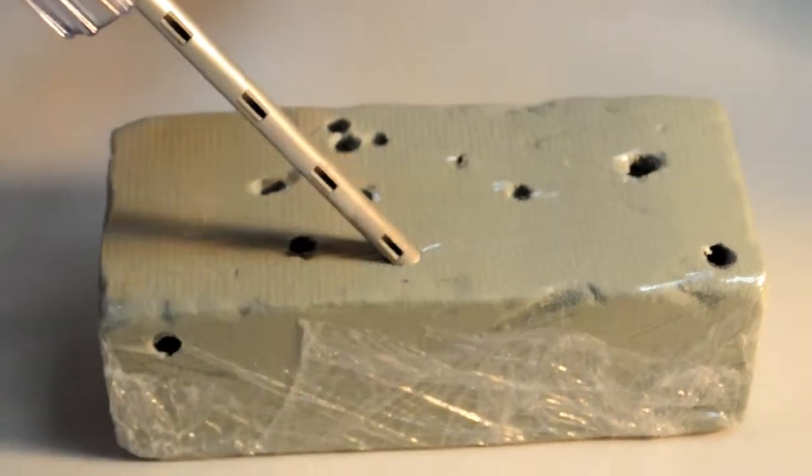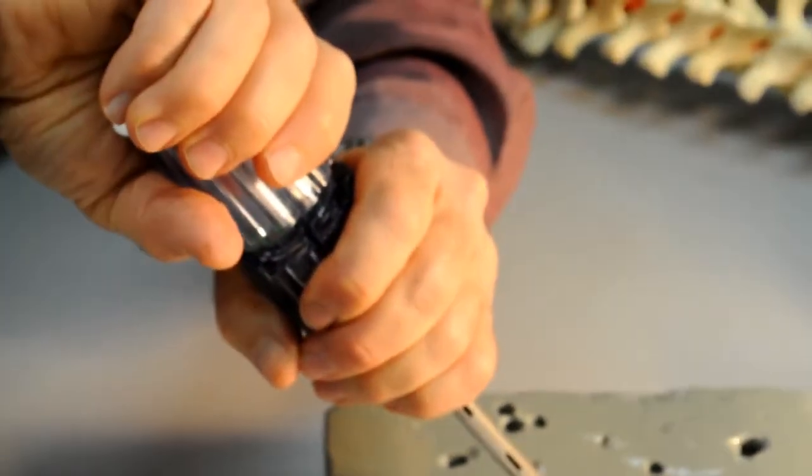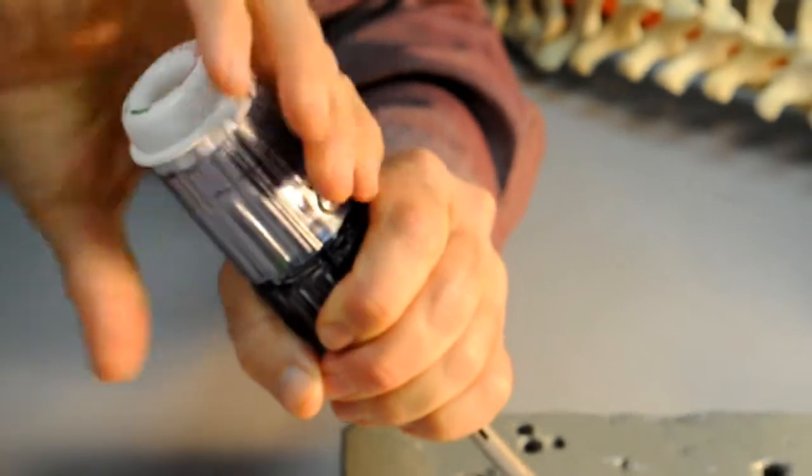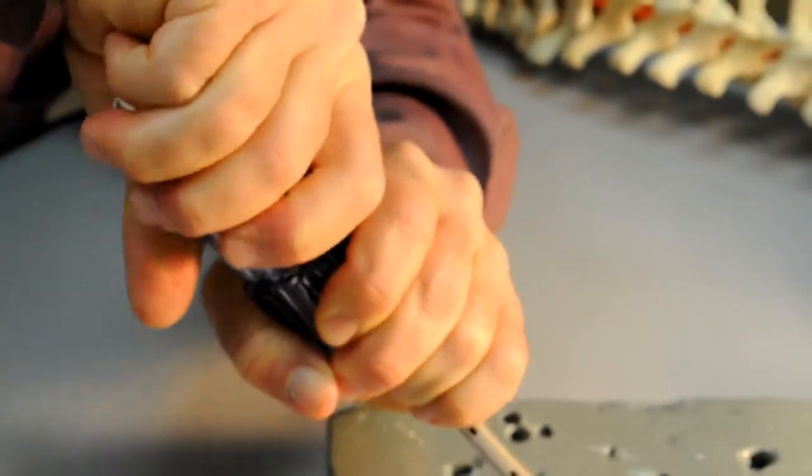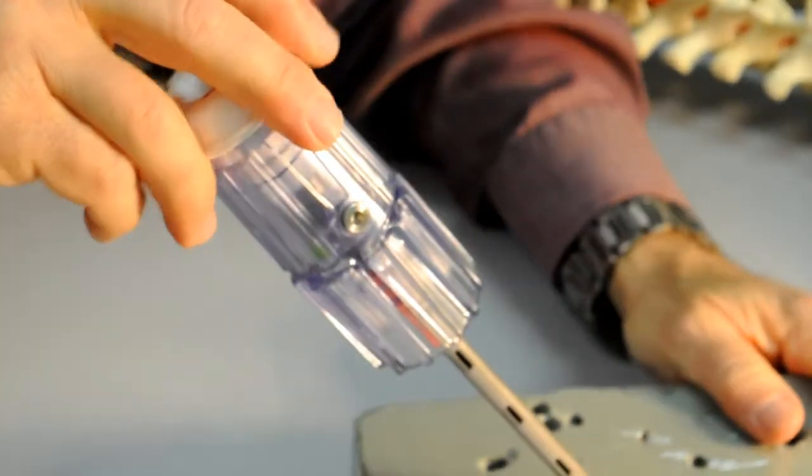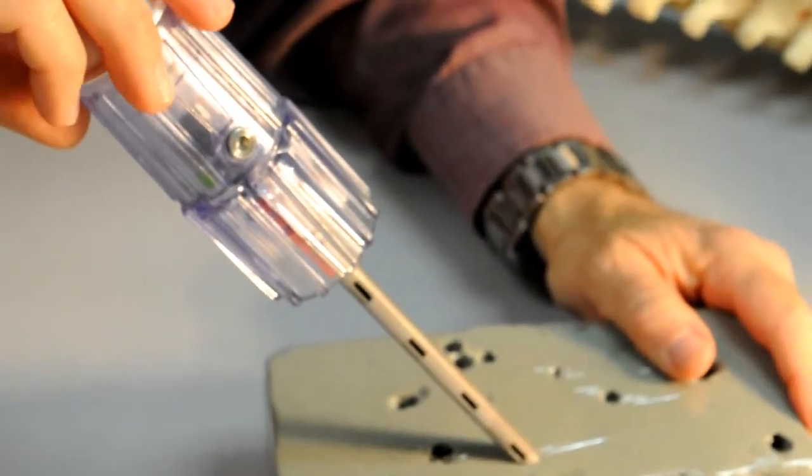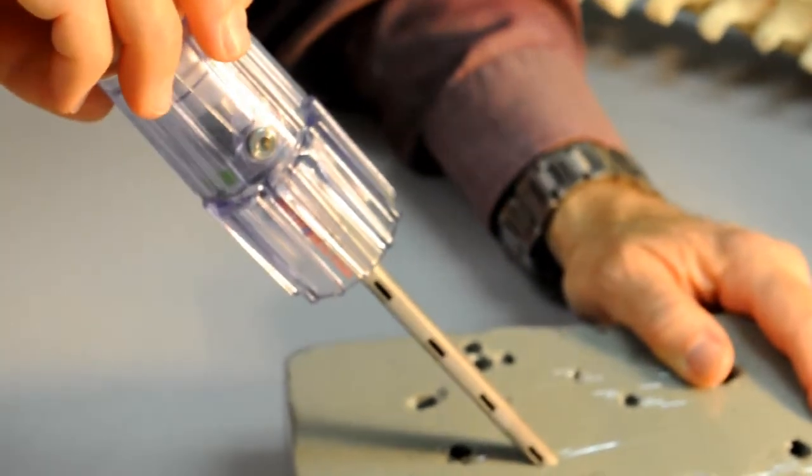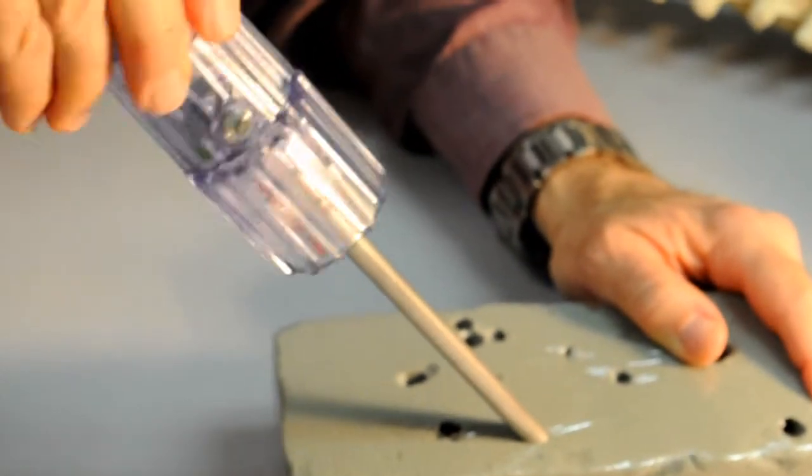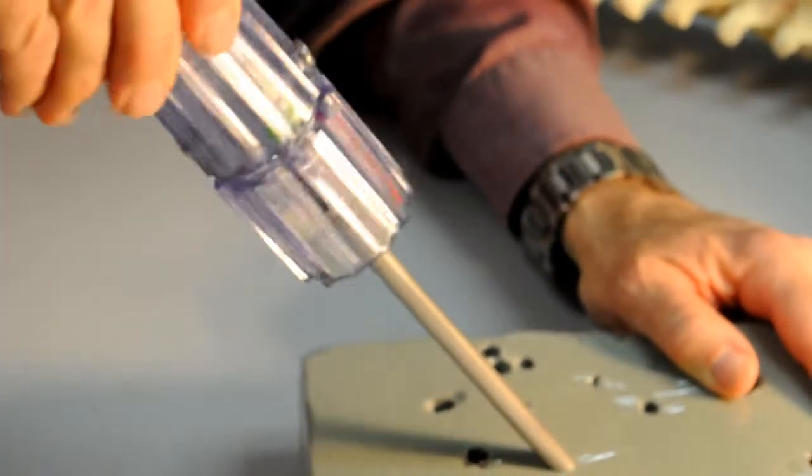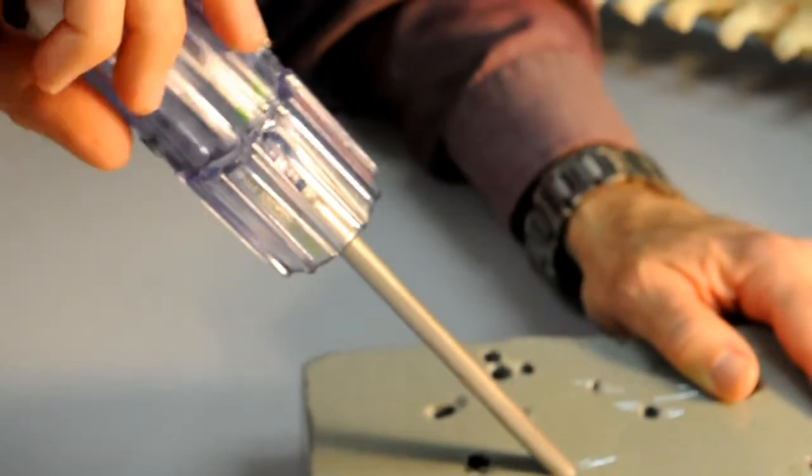At this point, we are going to lock and close the device. We'll do that by rotating the upper segment relative to the lower segment into a fully locked or clockwise position. Now we're ready to extract the cancellous bone and the device from the bone by rotating and pulling, always rotating in a clockwise manner.